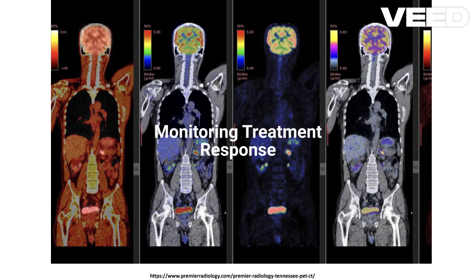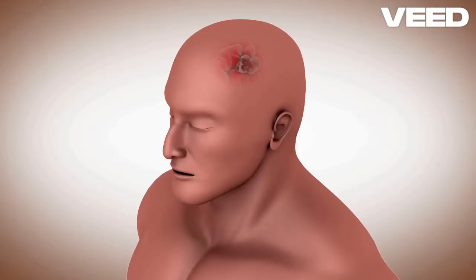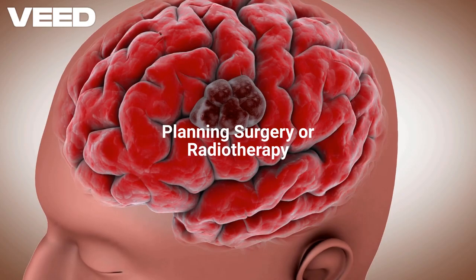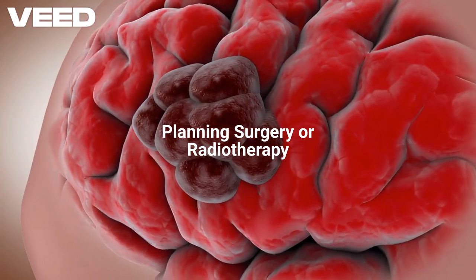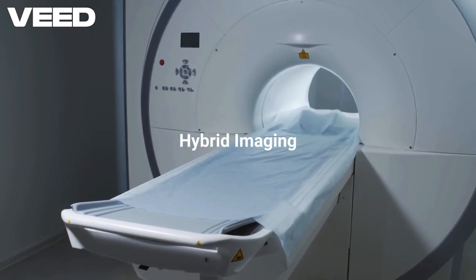Monitoring treatment response. If a treatment like chemotherapy is working, the tumor's metabolic activity often decreases, and PET can show that long before physical changes appear. Planning surgery or radiotherapy. PET helps doctors pinpoint the most active areas of a tumor, guiding where to cut or where to target radiation.